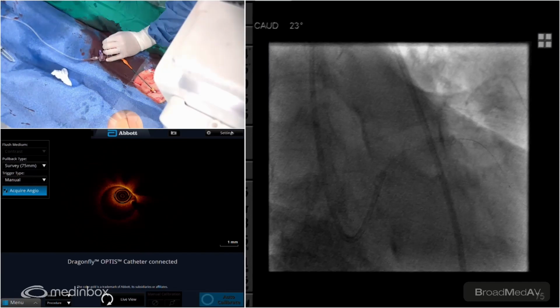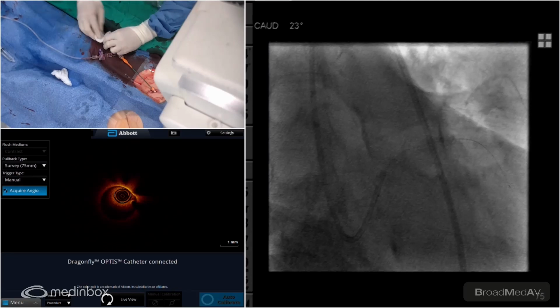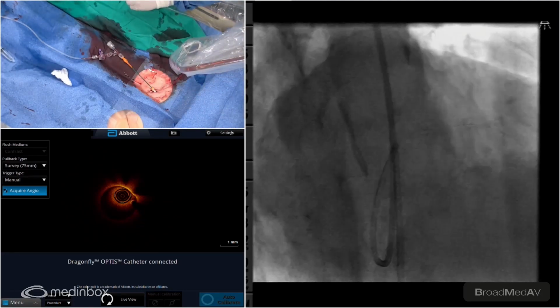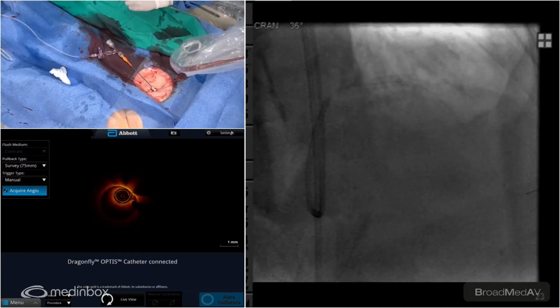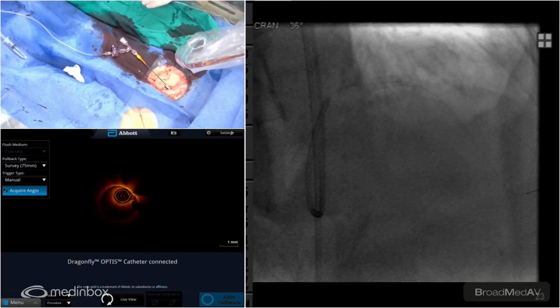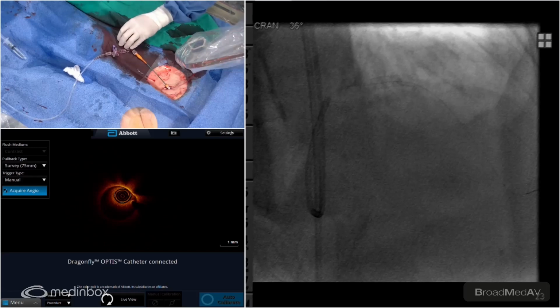Get the microcatheter, please. We'll get a trapping balloon as well. Yeah, Turnpike works. Everybody has their own favorite microcatheter for these things. I find, at least with the Turnpike Spiral, it helps you get around some of these angulated lesions. It gives you a lot more push. Let's get a 2.75 trapper, please. Slush. And now let's get the RotaWire too. We'll wait for the trapper.